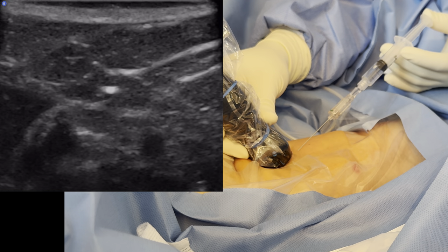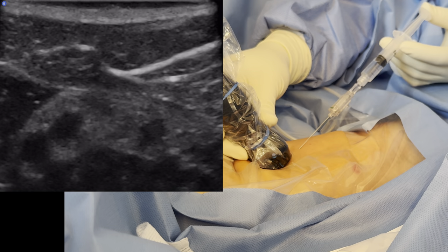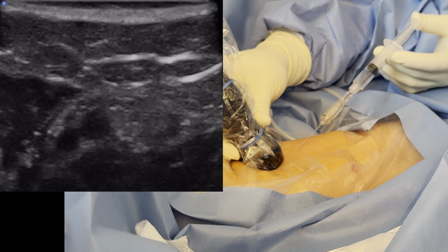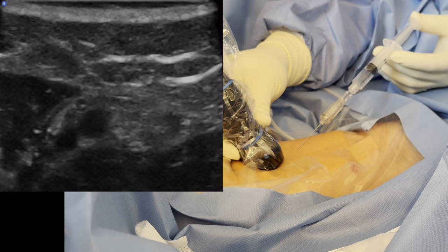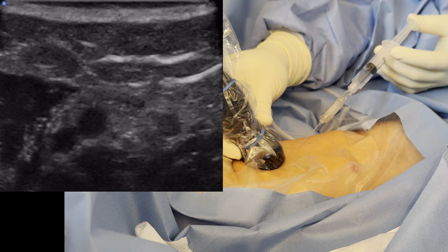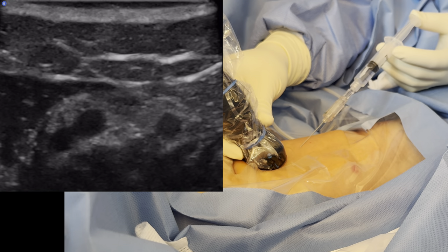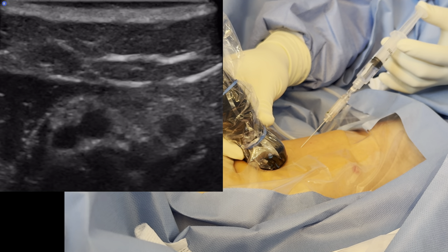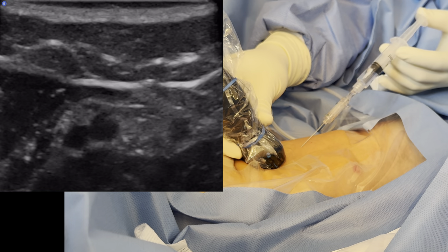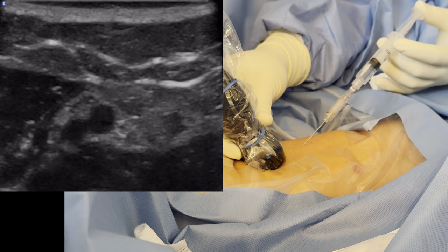I'm going to keep the needle still, then slide the probe until the tip disappears, go about a millimeter or two past the tip, and then bring the needle back into field of view of my probe. Do you guys see this needle tip right here? I'm going to inject a little bit of lidocaine. Do you feel burning in your arm? No — that's good. I want to make sure she doesn't feel that dilator. I've had patients in extreme pain when the dilator went in — not at the skin, but felt deep in the arm. So I like to coat the vein with lidocaine.